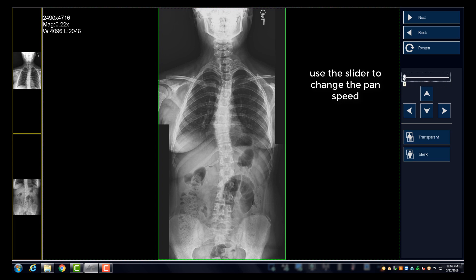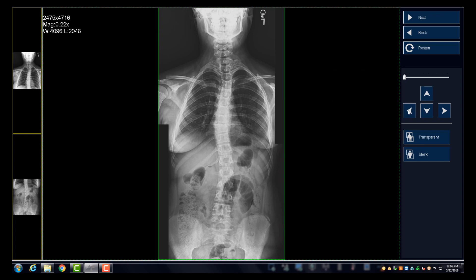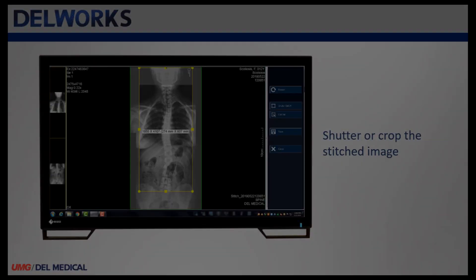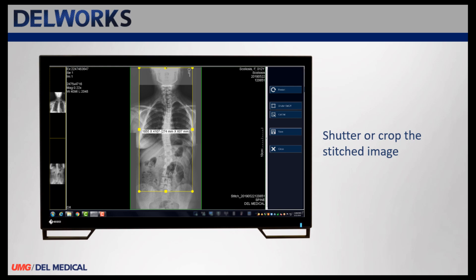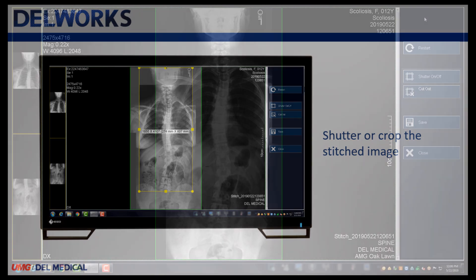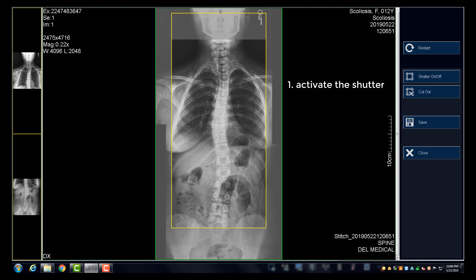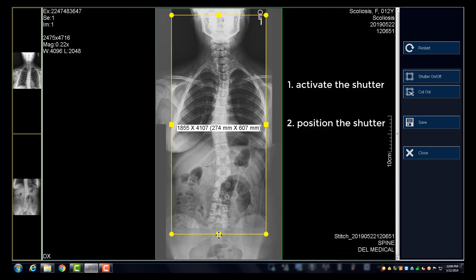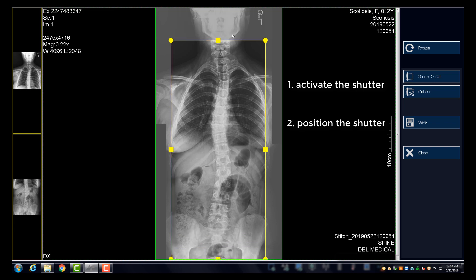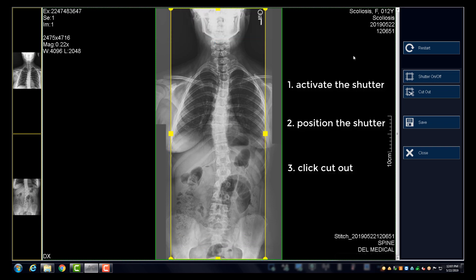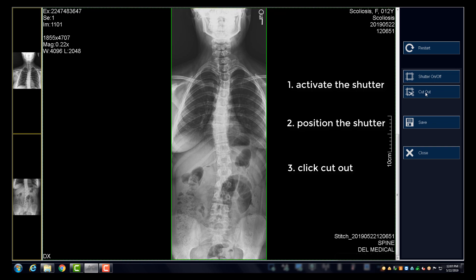The slider also allows you to adjust the shutter or crop the final stitched image before sending it to PAX. Simply activate the shutter by clicking the shutter on or off button, then adjust the shutter box by dragging it into the proper position. Click Cut Out to crop the image and then Save.